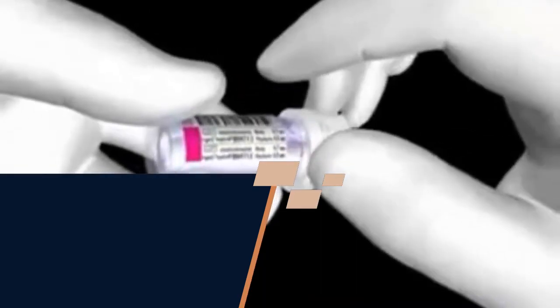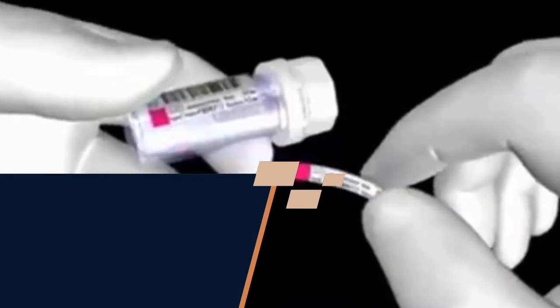Treatment planning. Based on the examination results, a treatment plan is developed. This includes determining the number of implants needed, the type of restoration, single tooth, multiple teeth, or full arch, and any additional procedures that may be required, such as bone grafting or sinus augmentation.